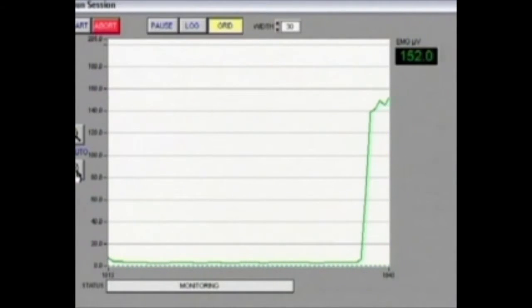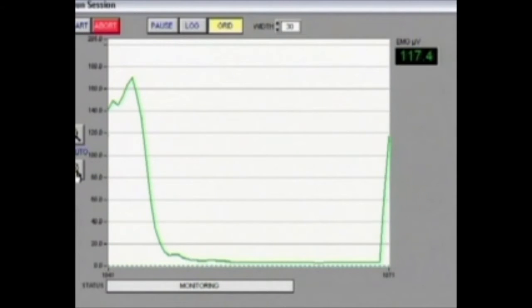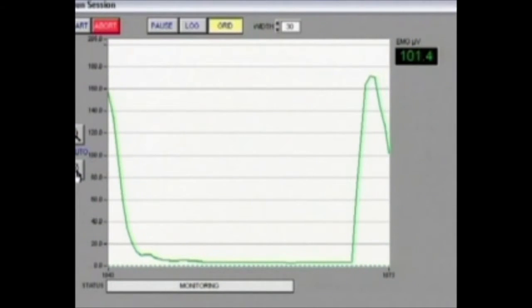That's the way. Okay, I think you got up to about close to 170 then, so just nice and relaxed. And that's pretty high. People who brux, clench and grind can generally get up over 160. People who can't are often well below that, so that's certainly an indication that those muscles are developed and used to some exercise. So let's try it one more time. So just another clench, just as hard as you can go. And around 171, so that's pretty similar. So nice and relaxed with the jaw, because we don't want your muscles getting too tired for the demo.